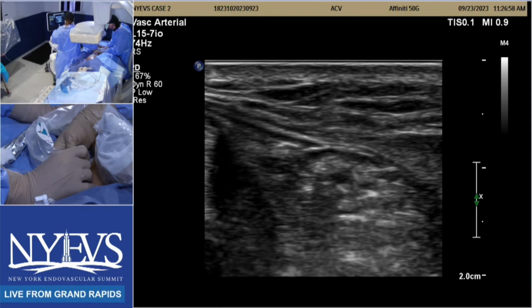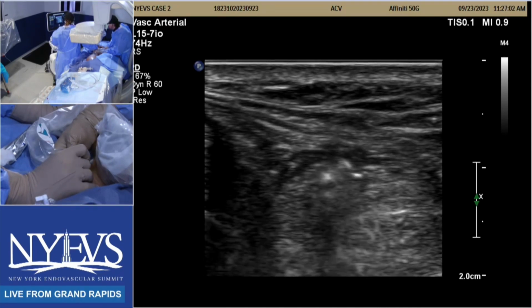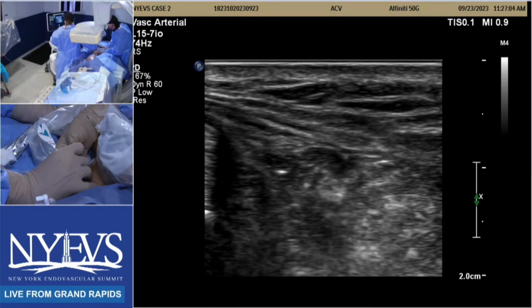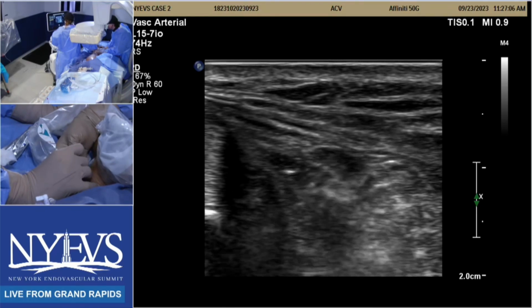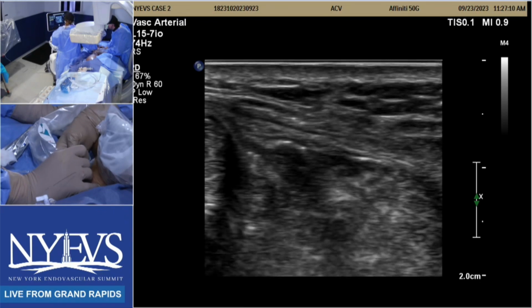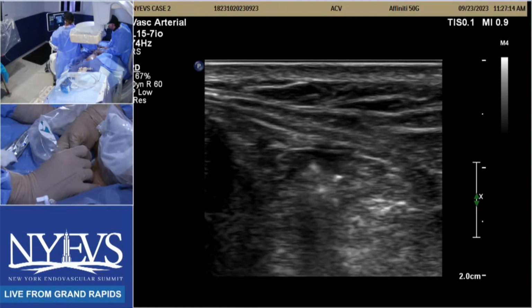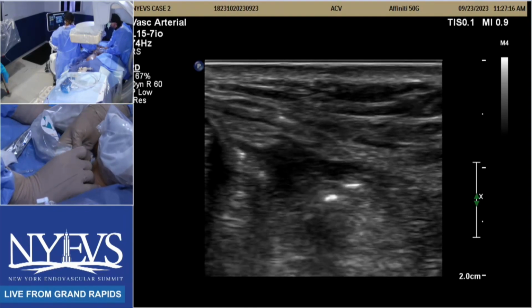In all likelihood, too, this is a really young patient. I would bet you the vein is not going to be great. Usually it's not. I may be surprised here. And even if you had a vein, you would bypass that AT? Is that what you would do? Not really, right? Not really the angiosome. It's not where the wound is. You're going to be trying to go into the medial plantar, somewhere down common plantar. That's got to be your target, in my opinion.